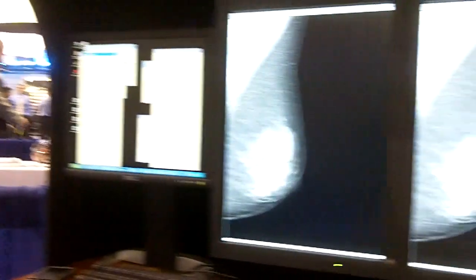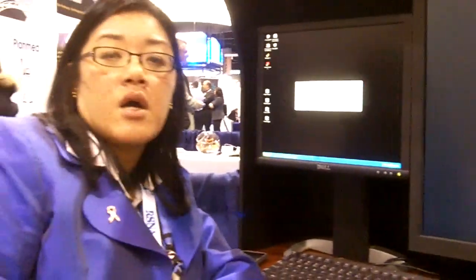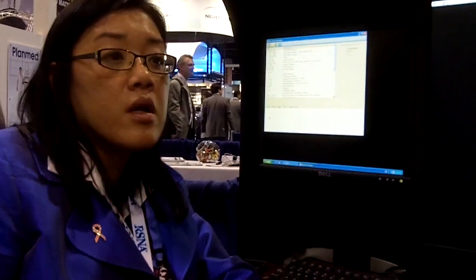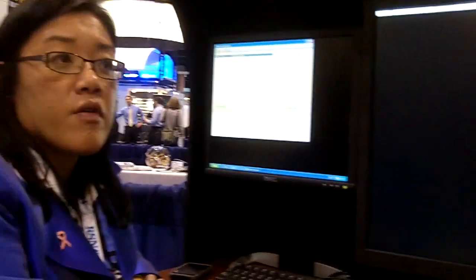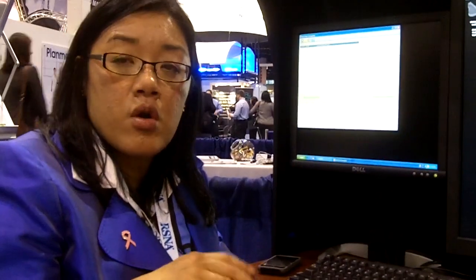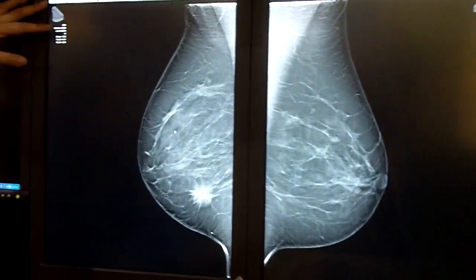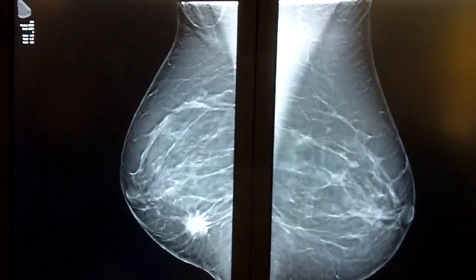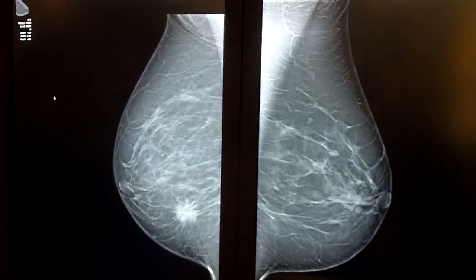I'll show the 3D now. This is the Adara GPU, and we also have a works-in-progress for Digital Breast Tomosynthesis. Digital Breast Tomosynthesis is a 3D imaging modality that has had approval outside the U.S. and is pending approval in the U.S. What Digital Breast Tomosynthesis allows you to do is look at a 3D image of the breast. This 3D image is reconstructed from 2D projections acquired over an angular range — there are 15 projections in this particular case.